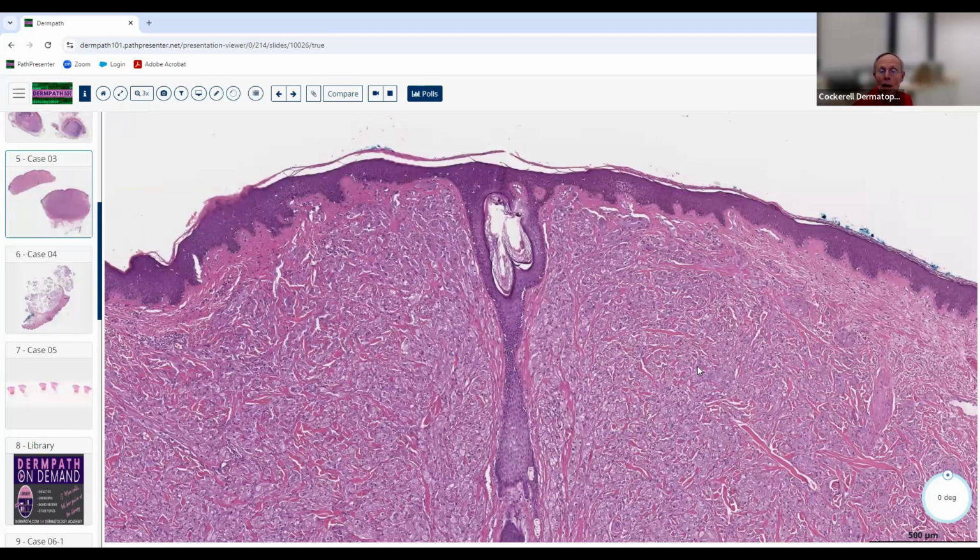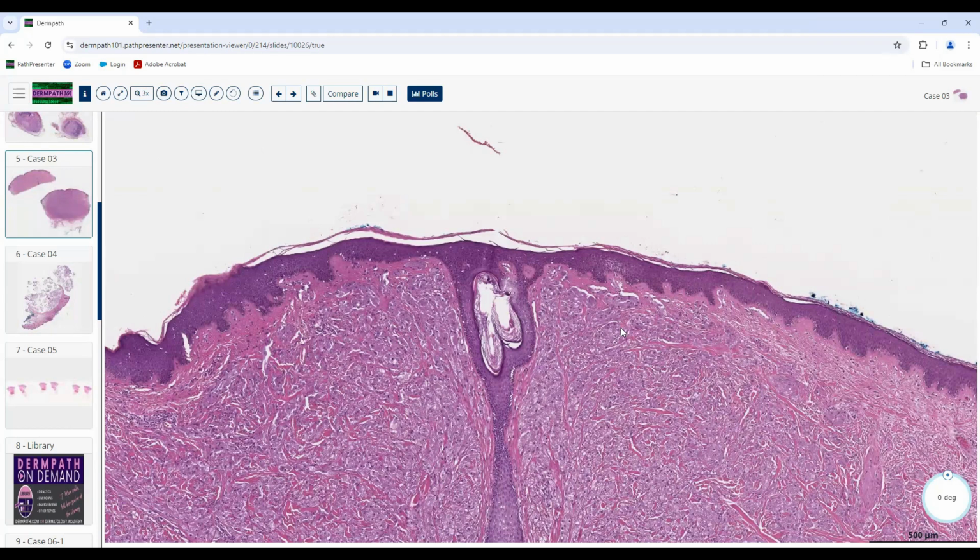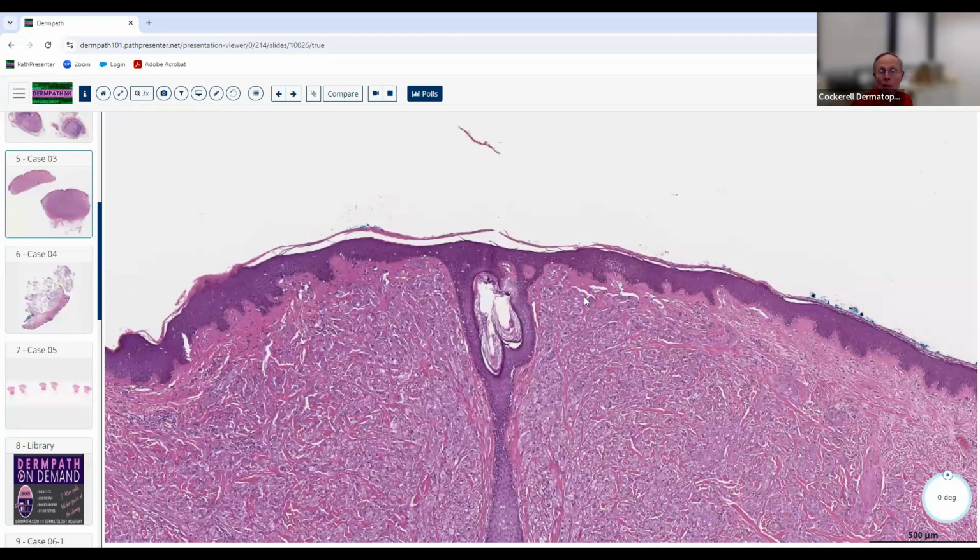So just make sure that you know that. They might even show you a clinical photo of a lesion on the tongue. And there's one last thing that we often see that we don't see here. That's a pitfall in the diagnosis if you get a shaved biopsy of a granular cell tumor. You can see pseudoepitheliomatous change. Yeah, that looks like squamous. So good. I've actually made that mistake once or twice in my career too, where I got a superficial shaved biopsy and it looked like a squamous cell carcinoma overlying a granular cell tumor. So you've got to make sure that you get deep enough and get into the granular cells. If you just get like here and you've got marked pseudocarcinomatous hyperplasia, you're going to miss the diagnosis in many cases.